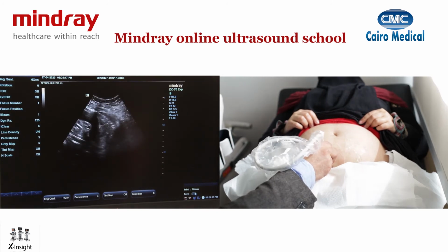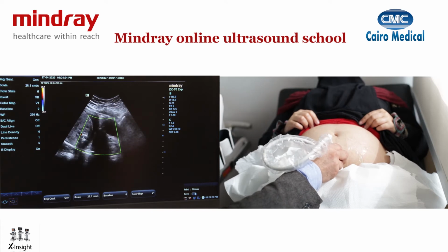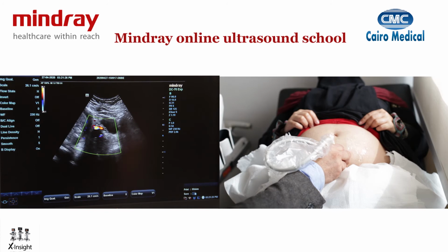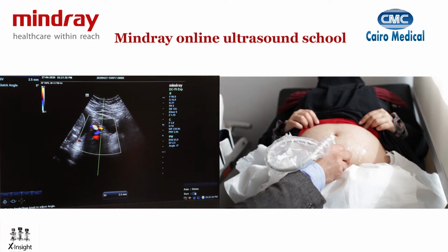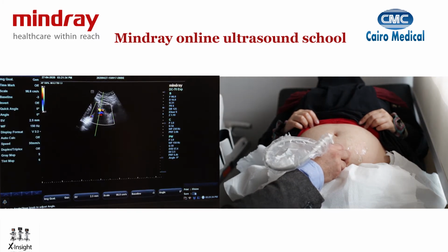I can then sweep again toward the left side with color Doppler on, so I can find the left uterine vessels. As you can see them here, and I'm going to put pulsed Doppler again on it and update.